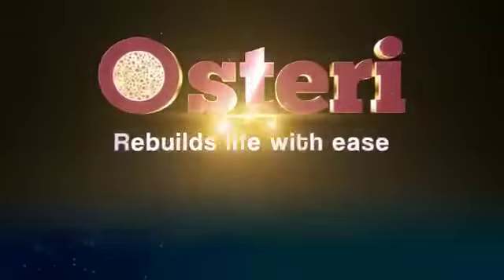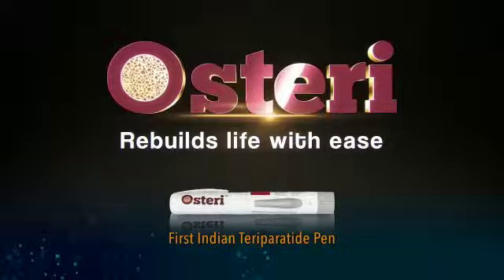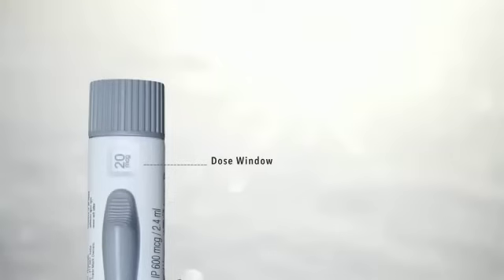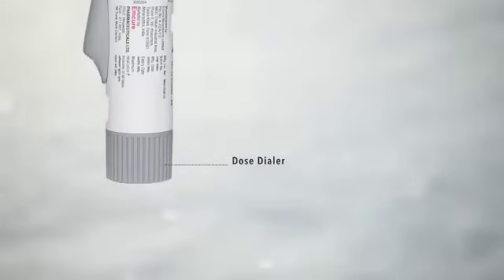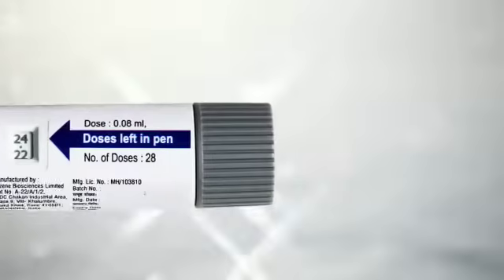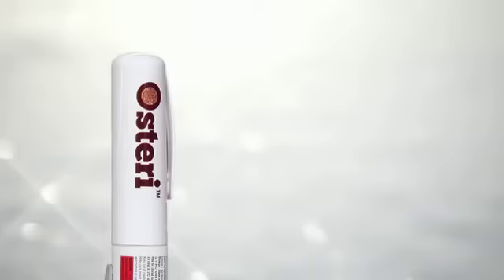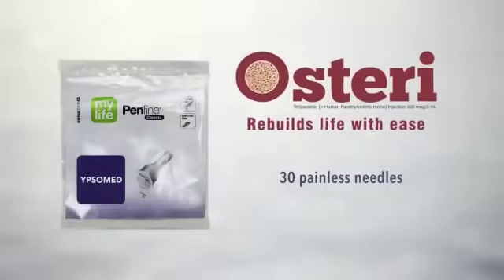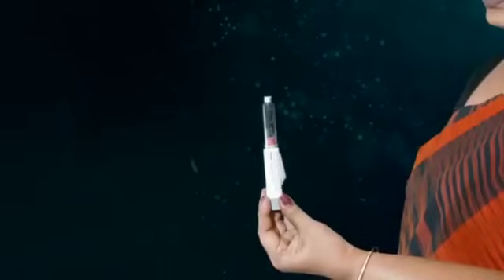Osteri — India's first teriparatide pen. The Osteri teriparatide injection pen comes with: number one, a pen which comprises of a cartridge holder, dose window, dose dialer, injection push button, dose counting feature, and pen cap; and number two, 30 painless needles.